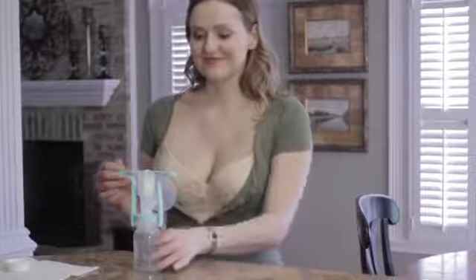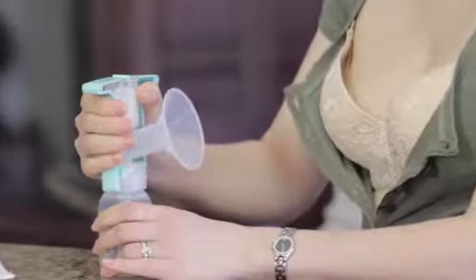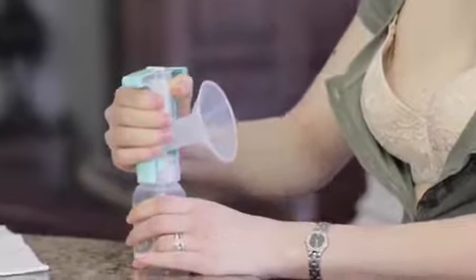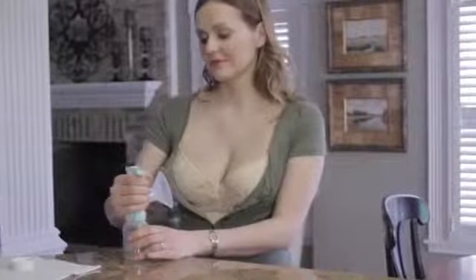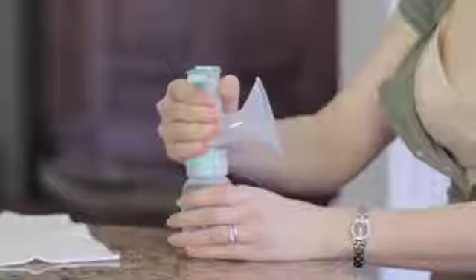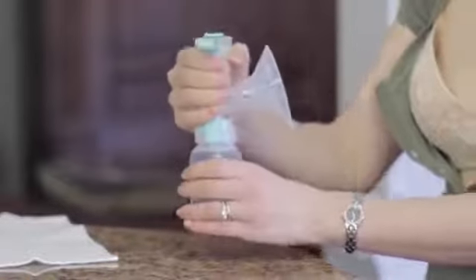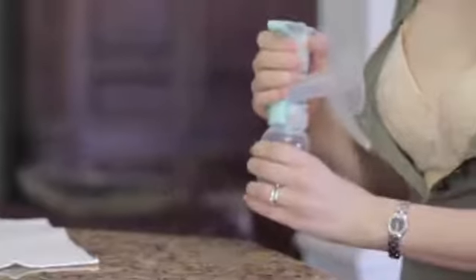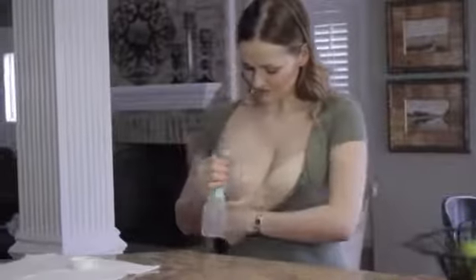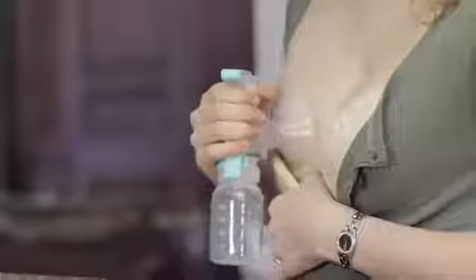The pump can be used with either hand. To begin pumping, grasp the handle with your thumb in front and fingers behind the upper chamber of the breast flange. Place your hand as high as you can on the pump handle with one side of the handle in the groove between your thumb and forefinger. Swivel the handle for wrist comfort.